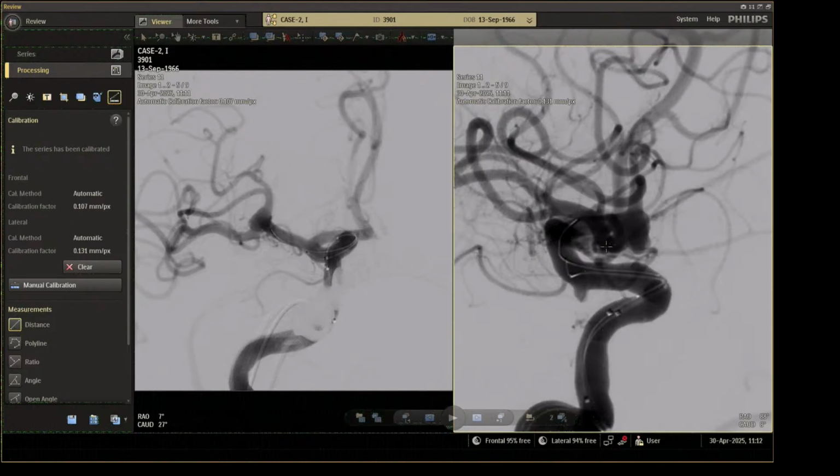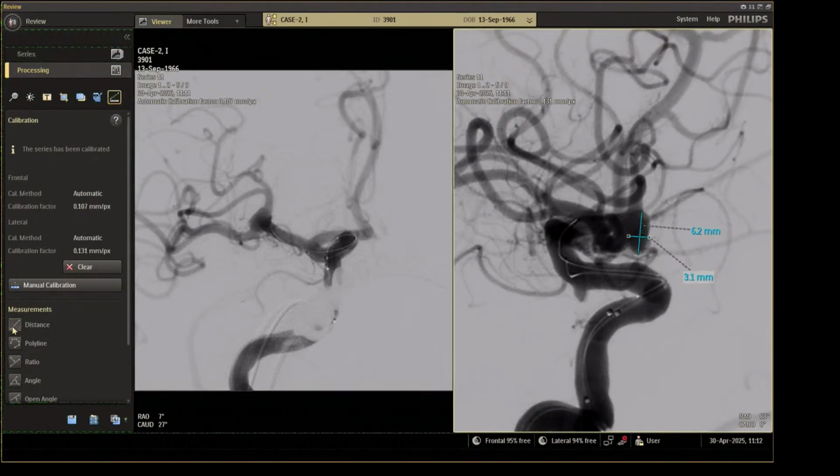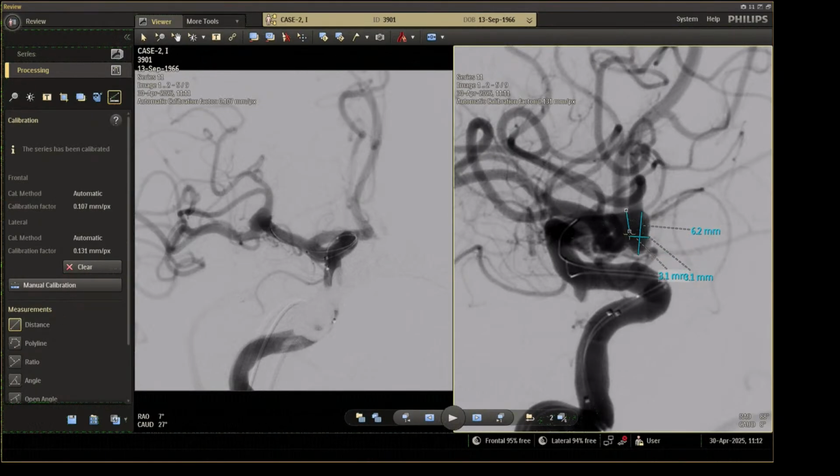It's something like this. This is a neck. This is a dome. Nearly 3 mm. From this part till this part, nearly 6 mm. But this part looks like aneurysm. We will place the stent like this, and some part of the stent will prolapse to the aneurysm, and we will cover some part here. And then we will place balloon here and coil this part. Okay.